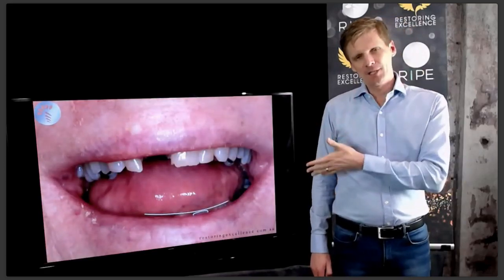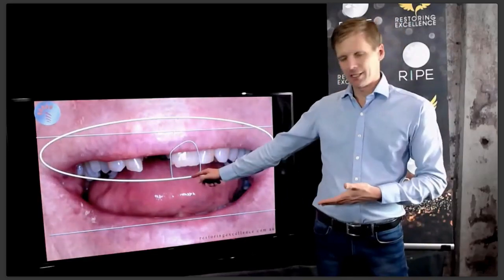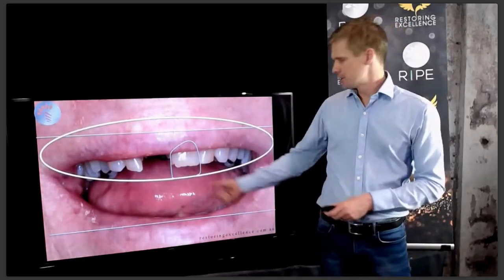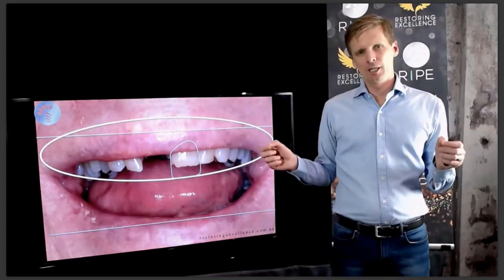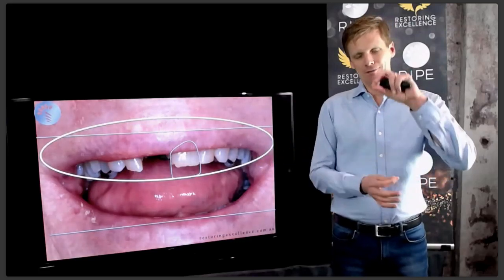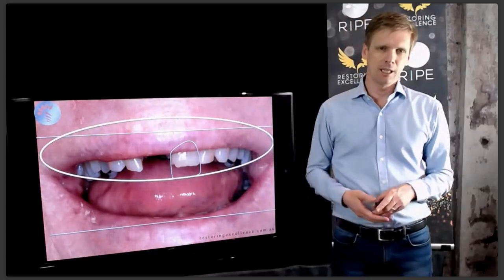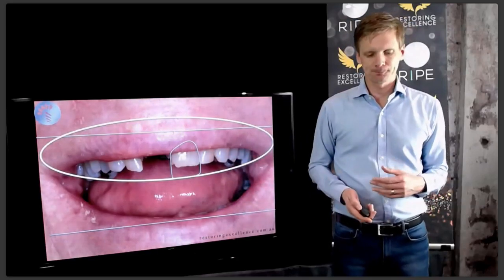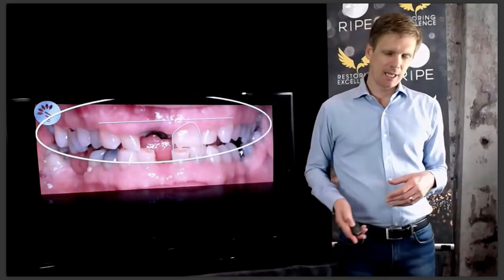So we've planned on this particular patient, if we go back, we've planned the upper incisal edge position. So we can measure that. We can calibrate this image and get a little ruler, PNG image, one of the clear images, stretch it over there and then turn it sideways and work out exactly how many millimeters we've added on in the photo. We can also work out how many millimeters we've added, taken gingiva away.